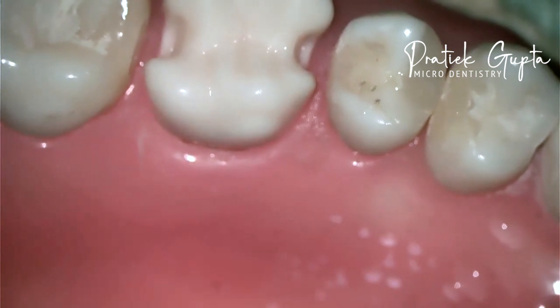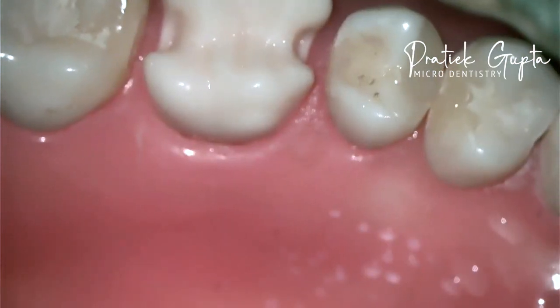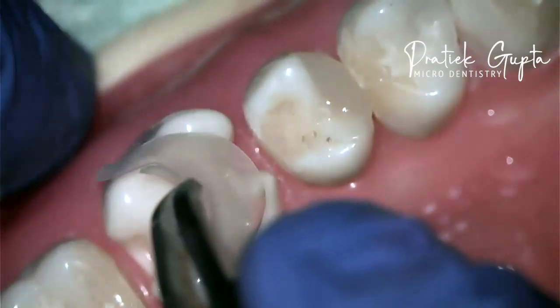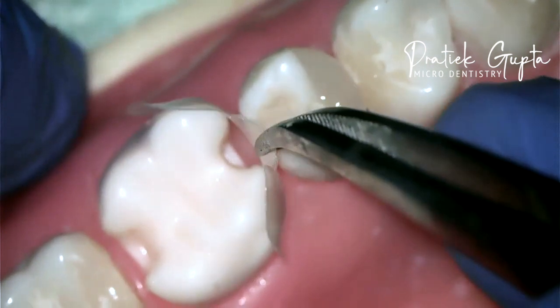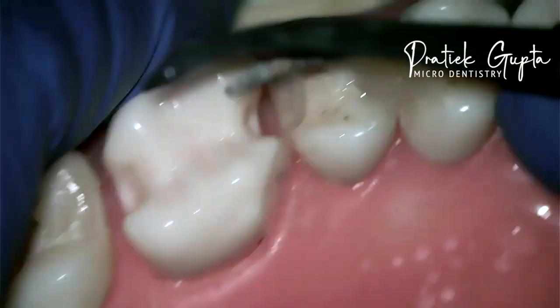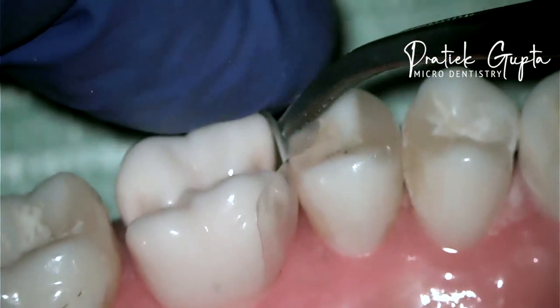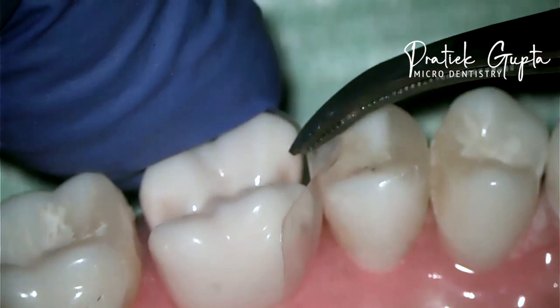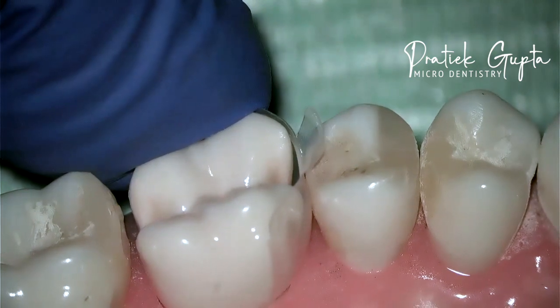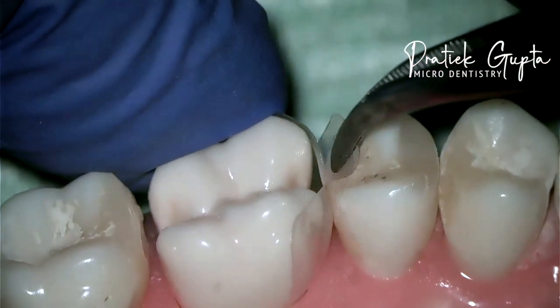After I select the matrix, I have to check one more thing: the matrix has to sit flush against the adjacent tooth's marginal ridge. Always insert the matrix and let it slide in — see how it slid in 0.5 millimeters and went to the gingiva. Once it goes in, you can turn the tab over and always check whether it is sitting flush against the adjacent tooth's marginal ridge so that you do not have a lot of excess to trim off. It's absolutely sitting perfectly against the adjacent tooth's marginal ridge, and that is why I will not have a lot of trimming to do once I do my injection molding.